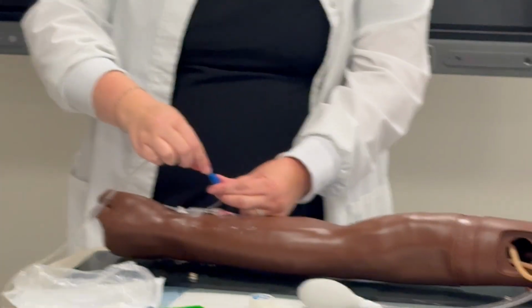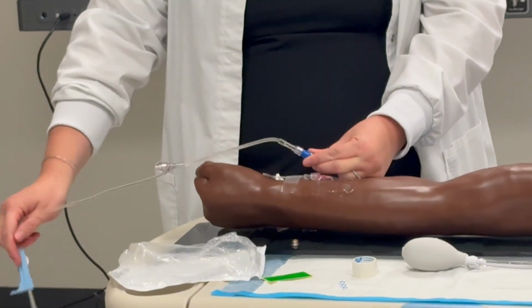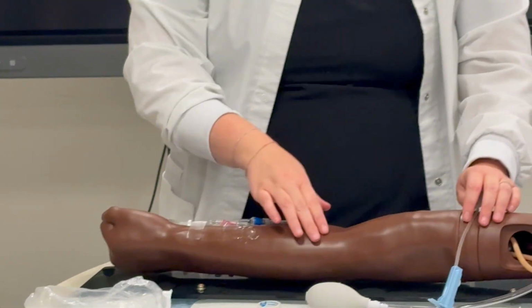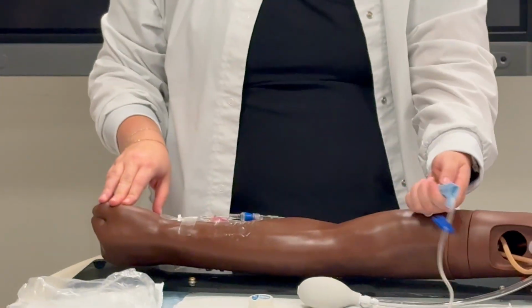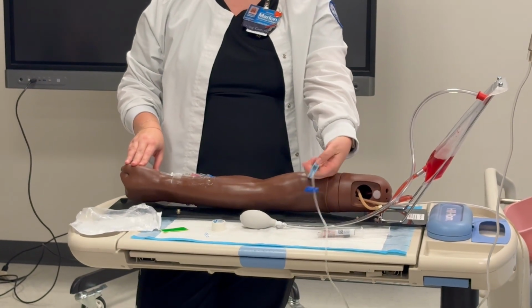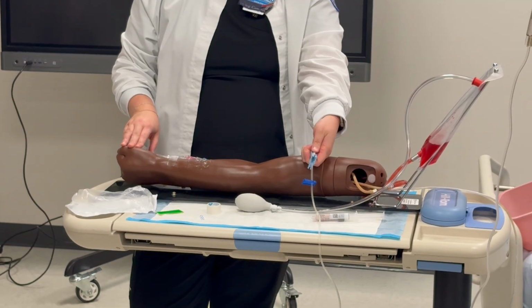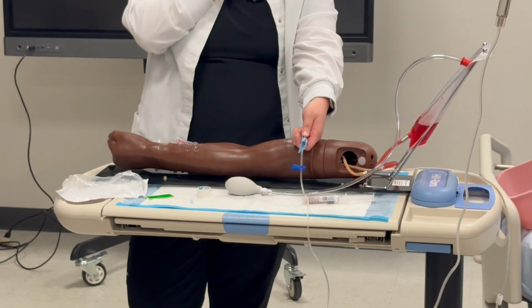Similar to the flush, we're gonna push and twist, okay? We already did our third medication check. And now we're going to test and make sure that this is infusing okay. So how to start infusing without a pump is we're gonna loosen our roller clamp. So I know that my medication is being infused because of the drip chamber.